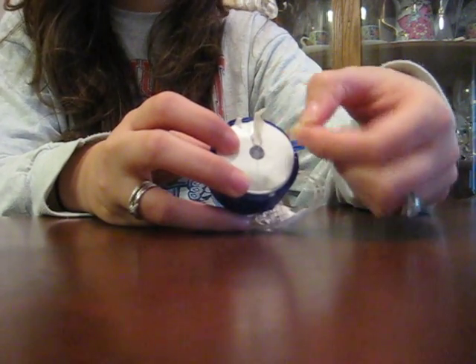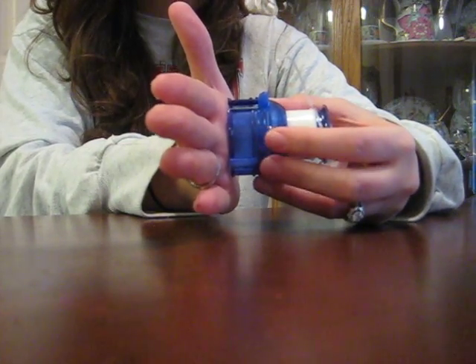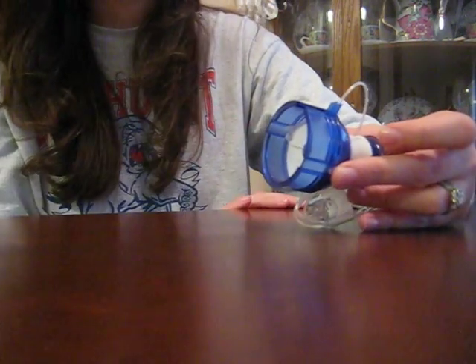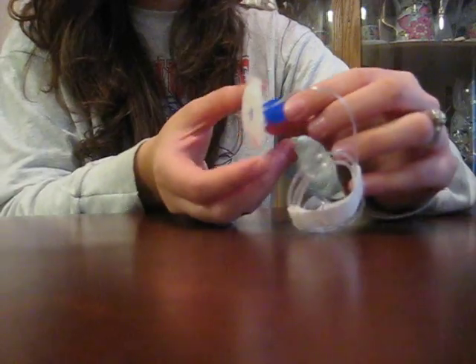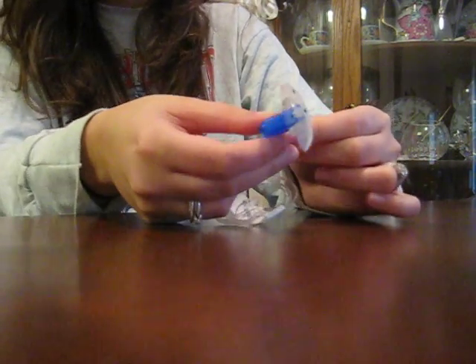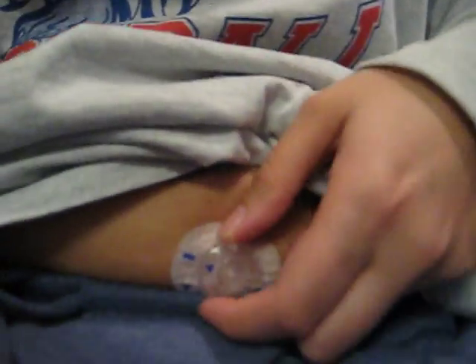What you do is take this, put it in here, and take these adhesives off because this is the part that actually sticks onto your skin. Then you push this down until it's ready, and you would just put this on your stomach or wherever you're going to put your infusion set, and you hit both of these buttons. When you hit the buttons it goes into your skin — very painless, you can't feel it at all. When it's finished, you pull the blue part out — all that blue stuff comes out with the needle — and you're left with the little plastic cannula. I'll just show you on my stomach — that's what it looks like. It's very flat, just looks like a flat band-aid with a little thing on it. It's completely painless; you don't even know it's there after a while.